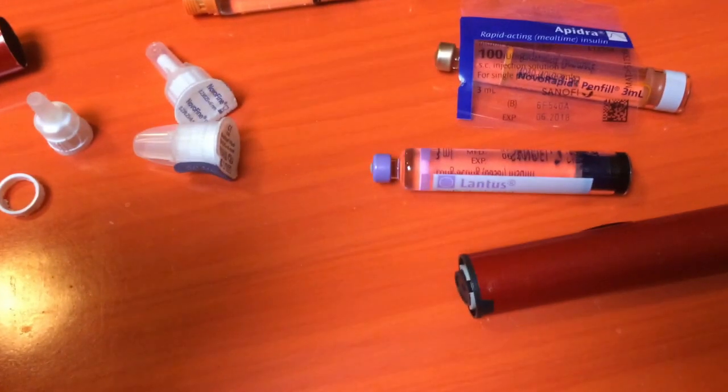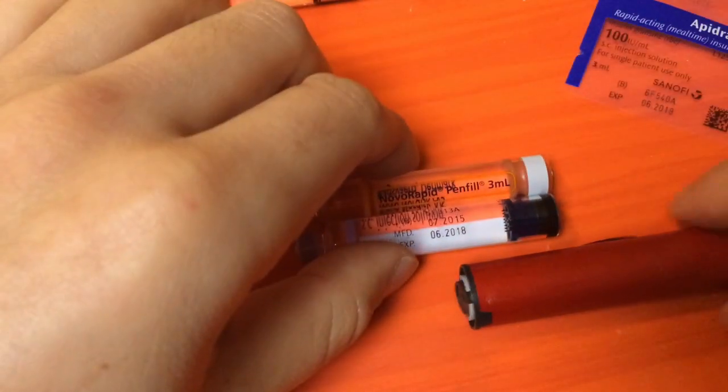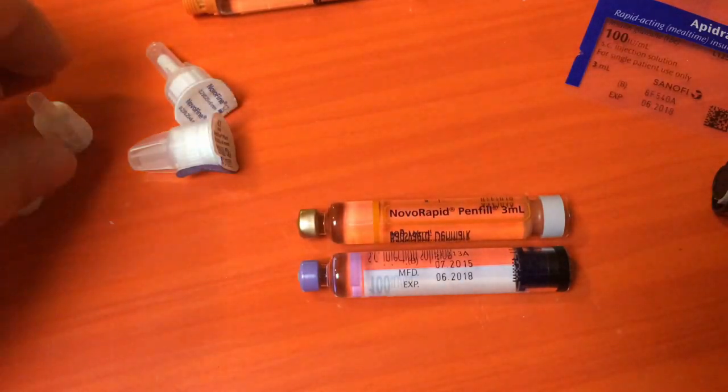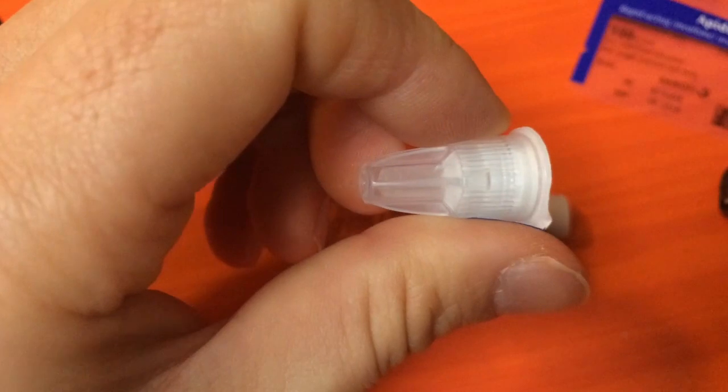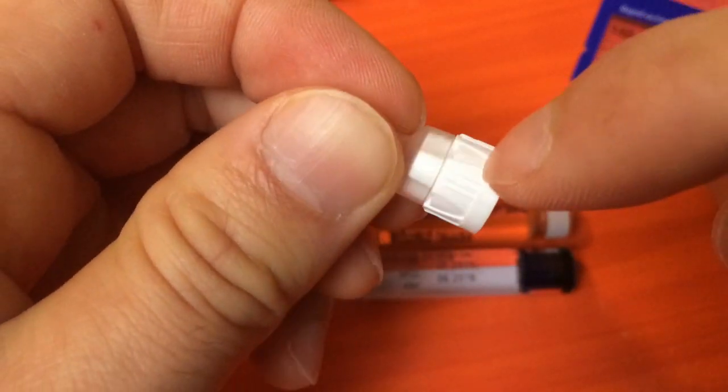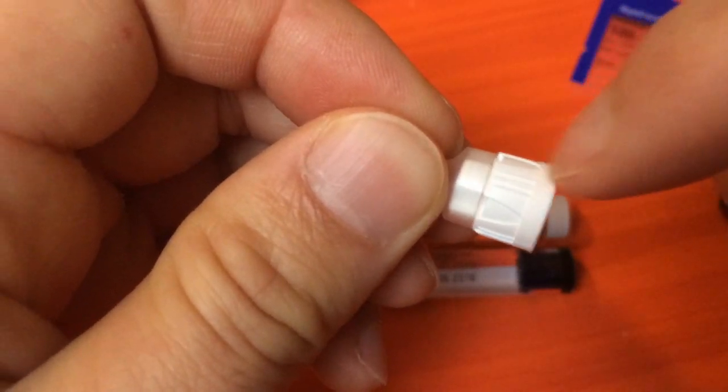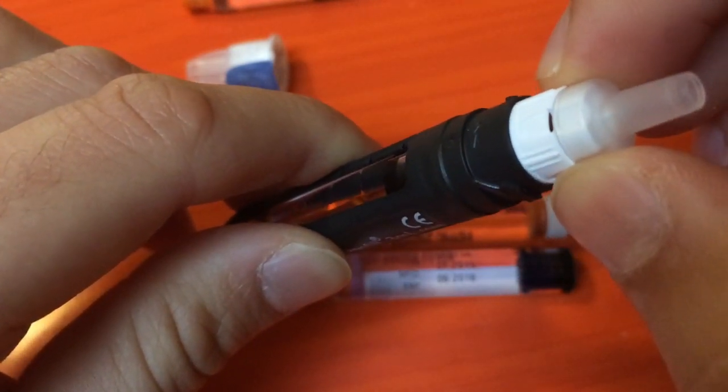Because of the length difference between the two types of vials, I got the NovoFine Plus needles. As you can see on the end here, there's a little end bit or lip. That just happens to be the right amount of plastic to make up the difference in length, and it also fits perfectly in the end of the vial holder.